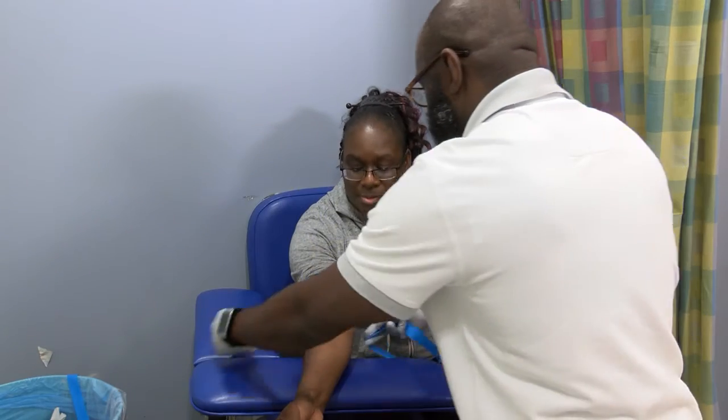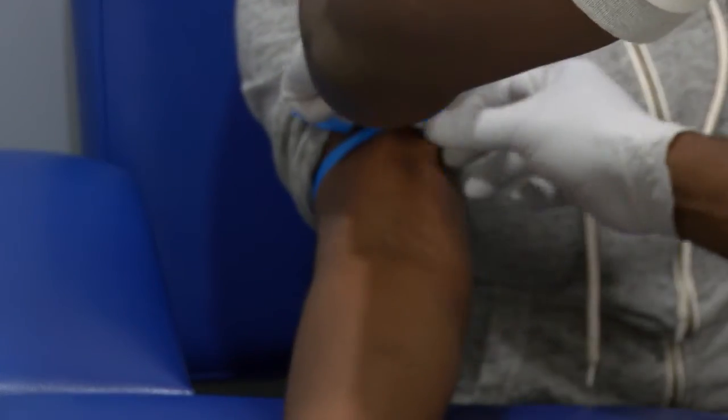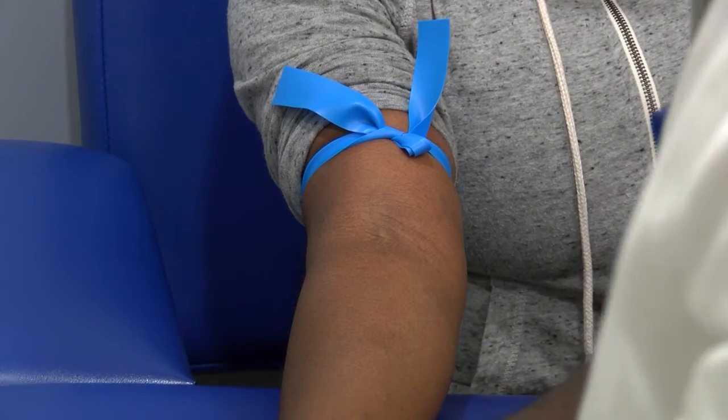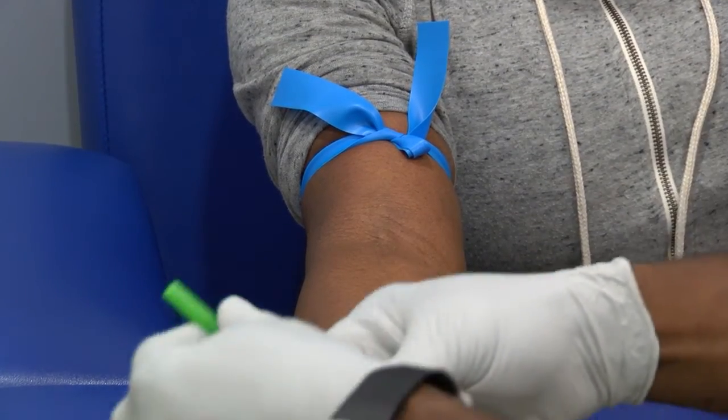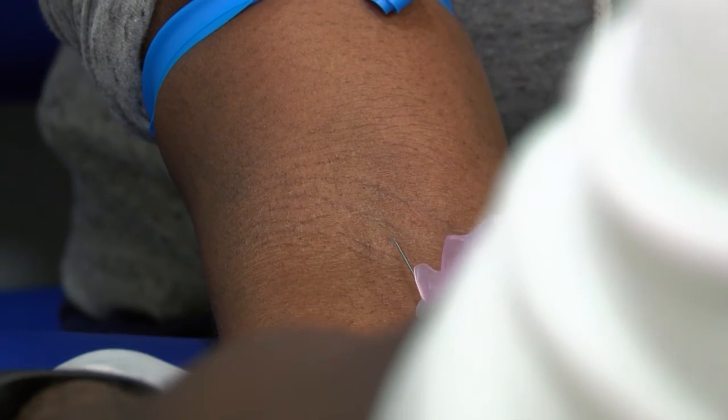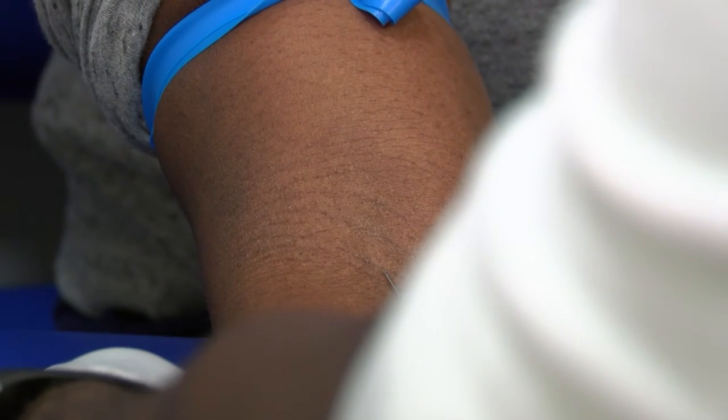Put this back again, okay? And this is not too tight. Okay, smell it? Okay. This is my needle. It might hurt just a little bit, okay? And I'm going to state it might hurt just a little bit, okay? Okay.